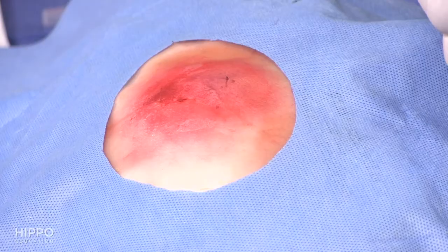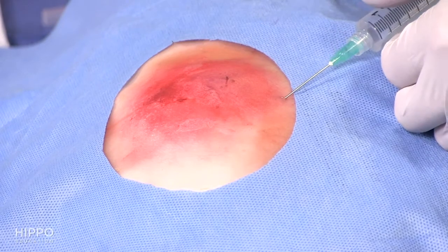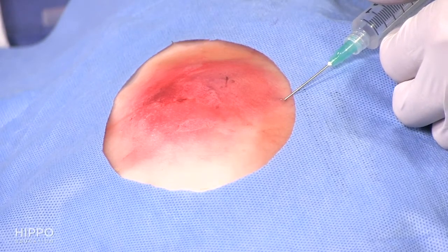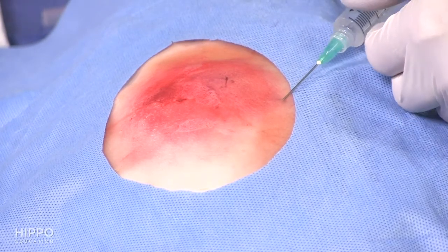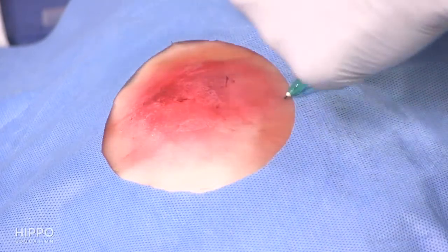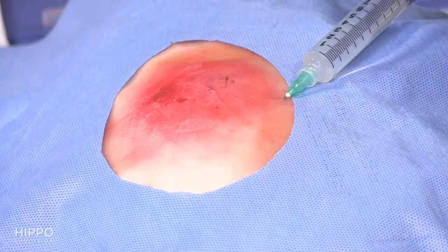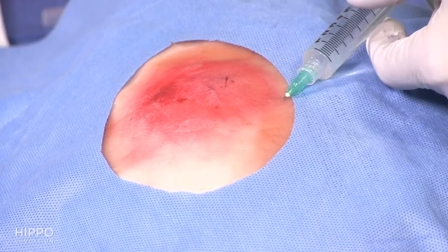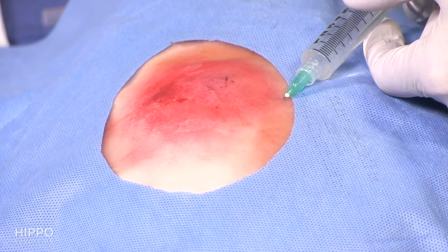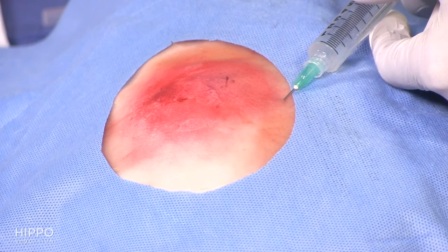And usually in terms of a field block, I like to start at the periphery. I'll make a small skin wheal so that you've got good anesthesia there, and then advance my needle, and you're basically forming a field around the cutaneous borders of this abscess. You want to try to avoid going through infected areas because you can just track that infection. So once I go in, you pull back to make sure you're not in a vessel, and then you just inject as you go along.